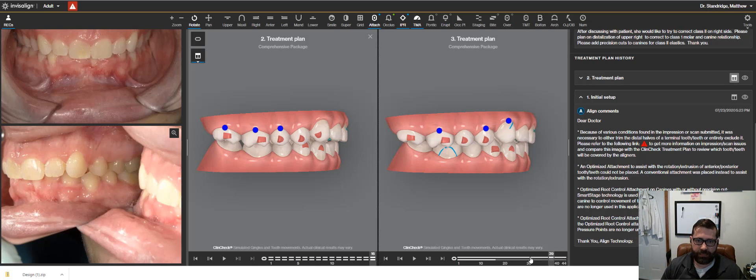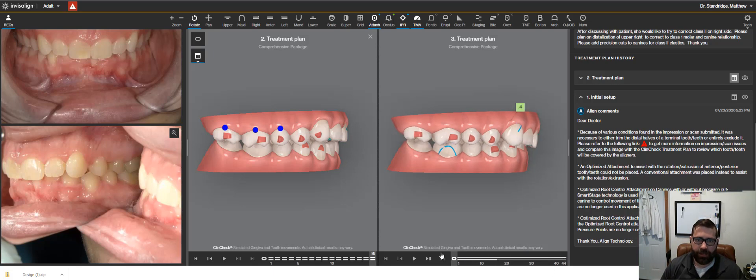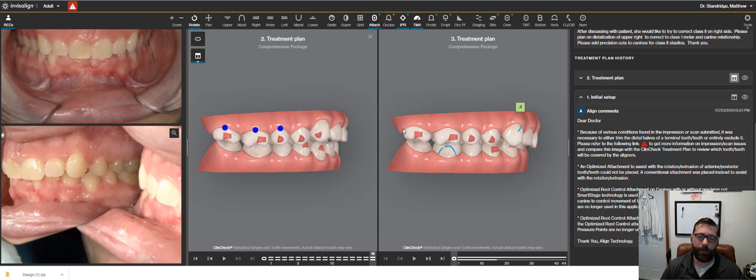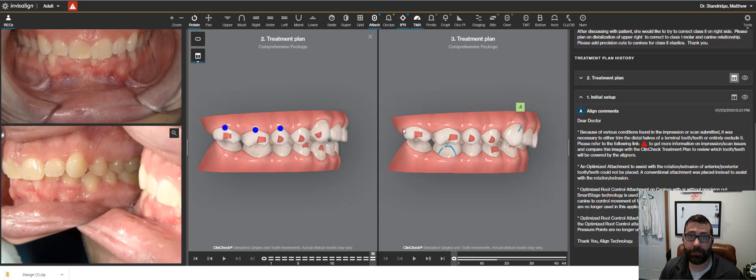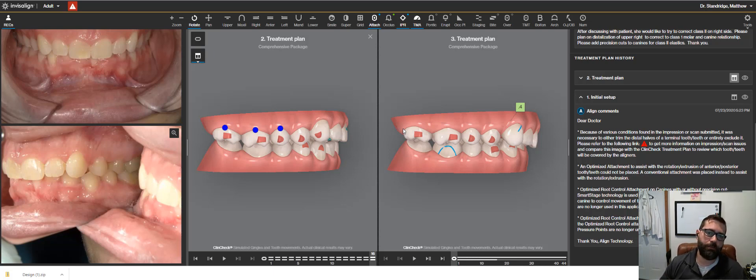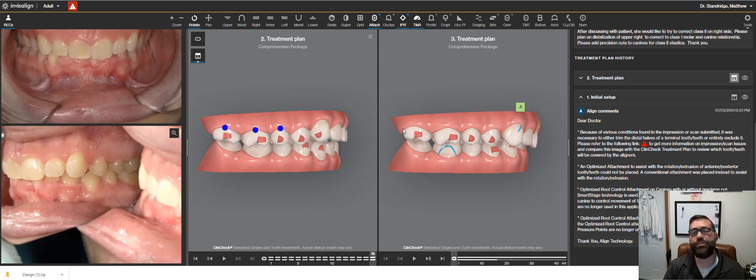So basically, if I take this back here, you're going to see these molars just kind of moving back one at a time. And I find if I am having to distalize more than just a couple of millimeters, so more than two millimeters, I use sequential distalization. It takes longer, but it's more predictable.